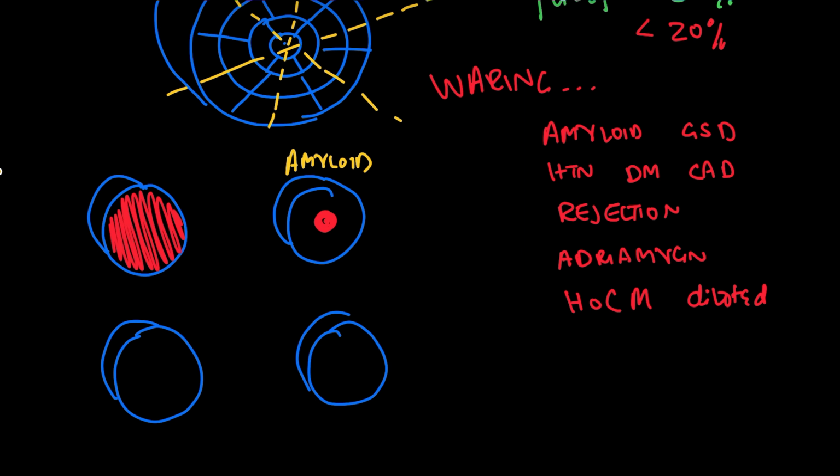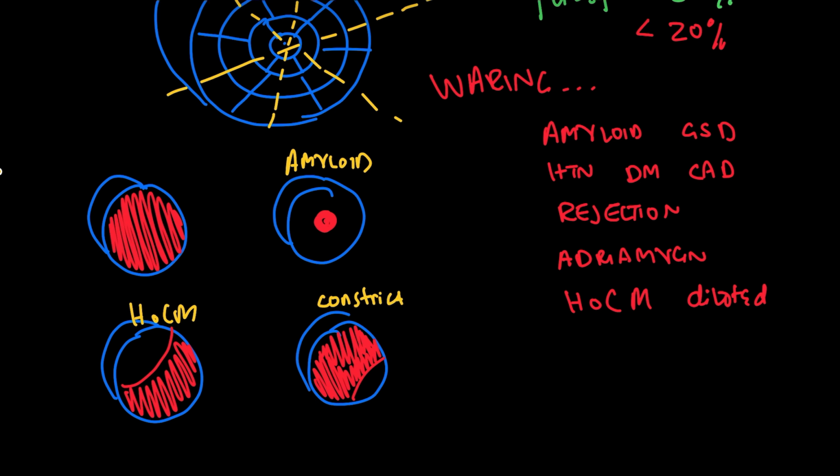What if you see that it is moving well, but not really in the septum, but it's moving well everywhere else? Well, then we would worry about HOCM. Is there something wrong with the septum, causing it to not move so well? What if we see instead that it is moving everywhere well, except it's not really moving so well out near the pericardium? Well, then we'd wonder, could there be some kind of a constrictive problem? Could there be some constriction going on? Something with the pericardium? And then this one, of course, here would be normal.